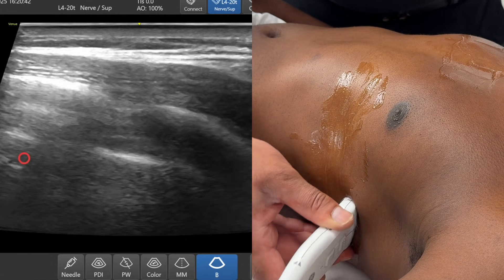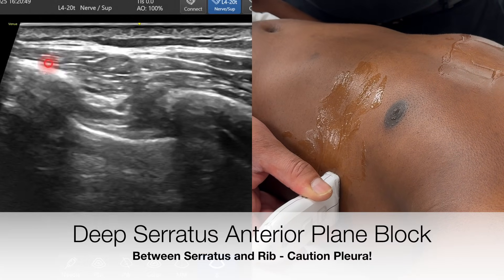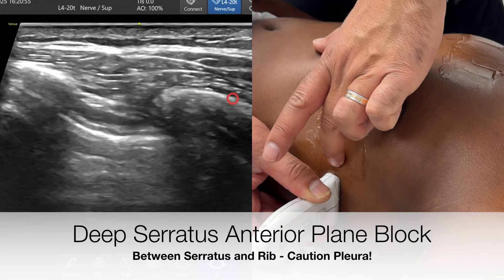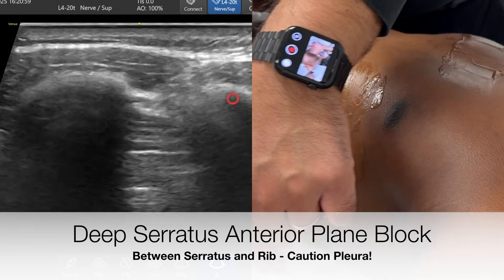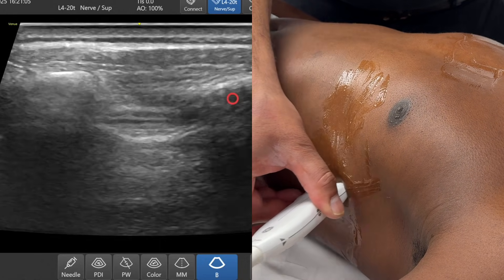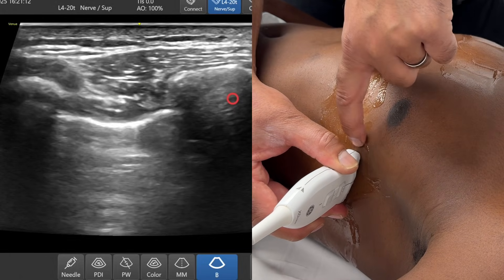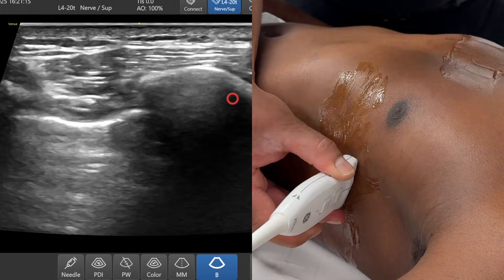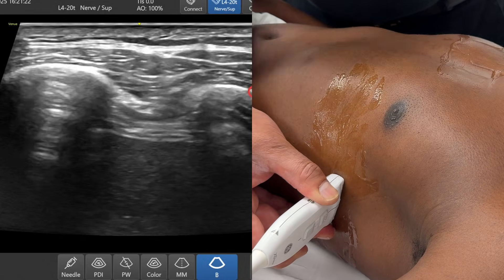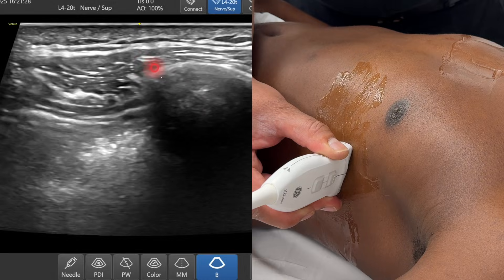I'm going to give you a different spin — I think it's actually much easier to make contact with the rib and to hydro-dissect the serratus anterior muscle up off that rib. If I'm going to perform a serratus anterior plane block, I come in from the anterior aspect. You could also rotate the probe through a few different orientations. In this anterior-posterior orientation, I can bring my needle in, make contact, lift serratus anterior up off those ribs, and with a long needle get a really decent hydro-dissection. I like to perform a deep serratus anterior plane block using the rib as a backstop.